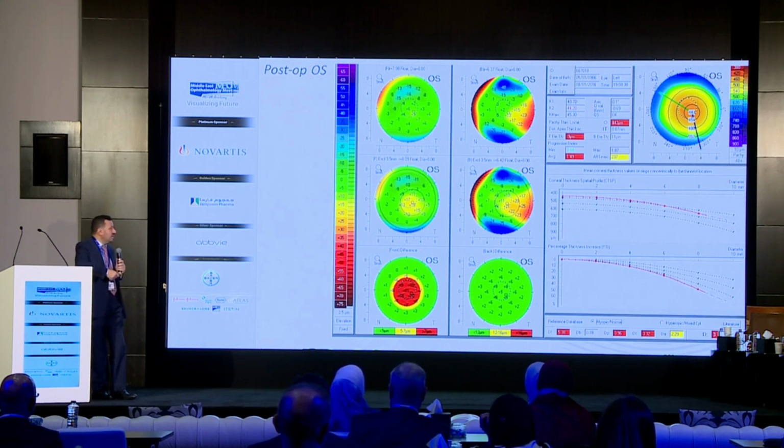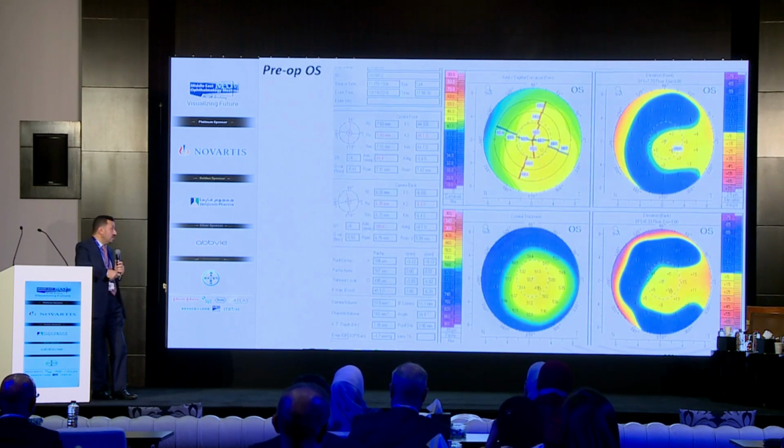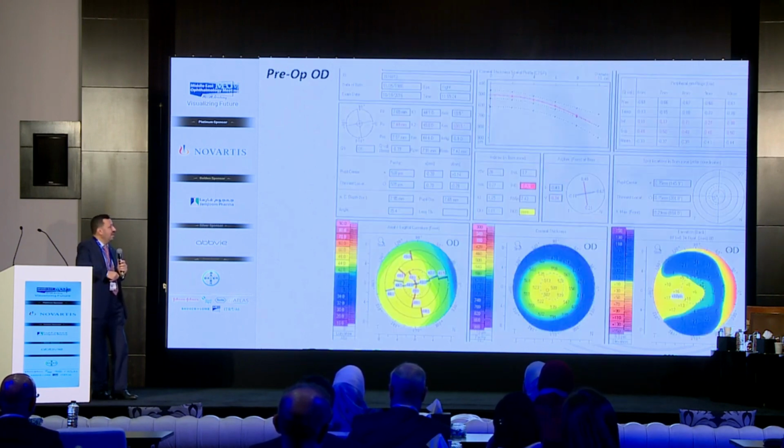Exactly. Yeah. This is what's explained, as I understand, because of the edema. There was some edema, yes, and haziness in the cornea when the patient first showed up. Yeah, we can say it is an edema definitely, and some ocular surface disease that was managed properly by the treatment, because there are no signs of ectasia, because the posterior elevation didn't change before the operation, or even the first time you saw the patient, and even after the treatment?